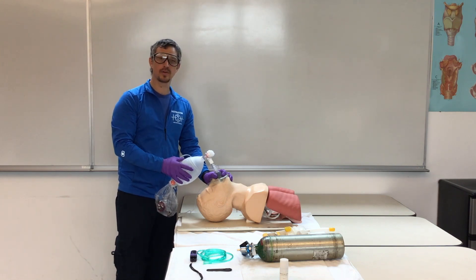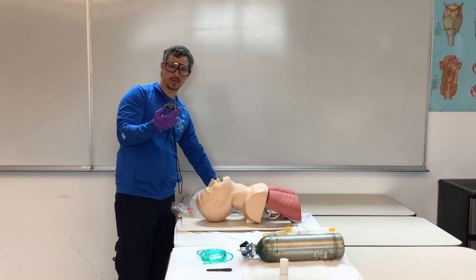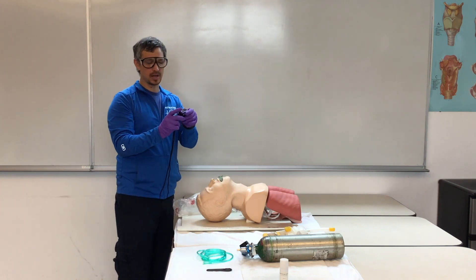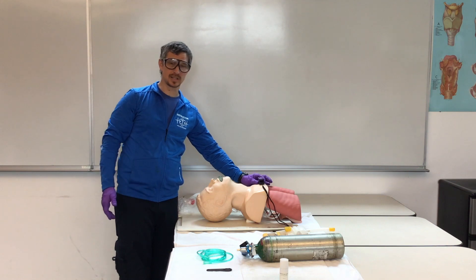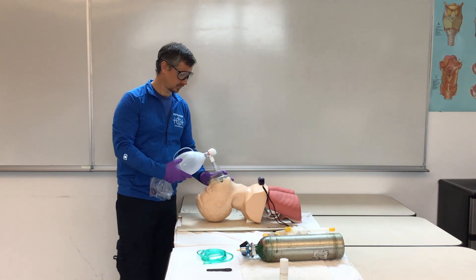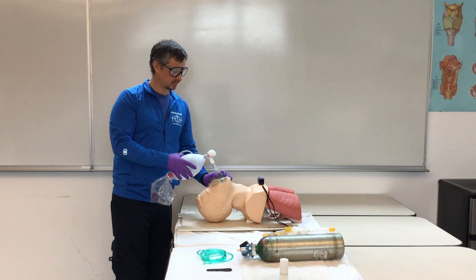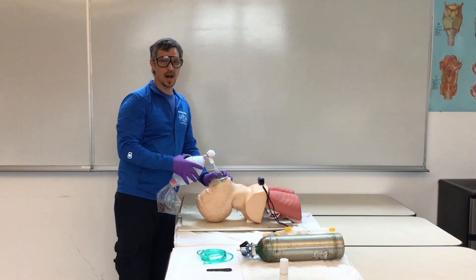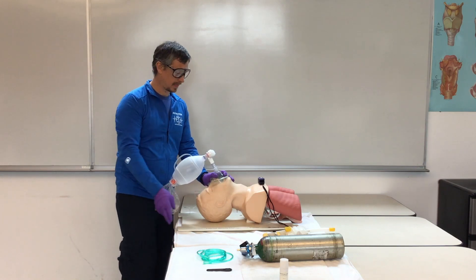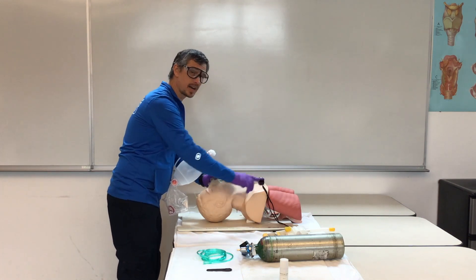We're going to ventilate our patient for approximately 30 seconds. Then we'll attach our SpO2, which monitors oxygen saturation in our patient's blood. Because our mannequin doesn't have arms or legs, we'll set it on their chest. If we notice oxygen saturation is low, oxygen is being provided through the BVM. We also make sure our patient still has a pulse, checking that they're not in cardiac arrest and needing CPR.